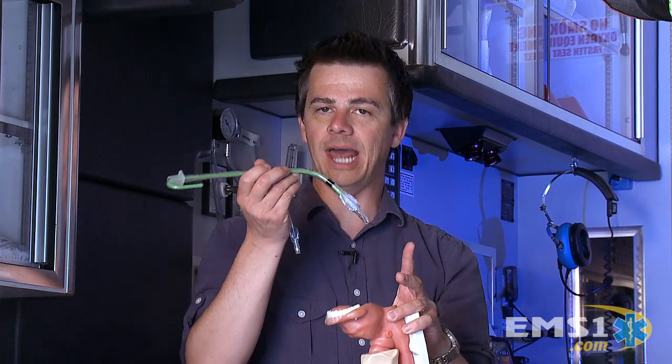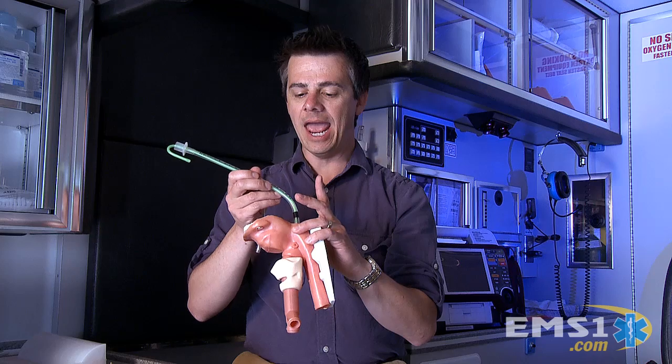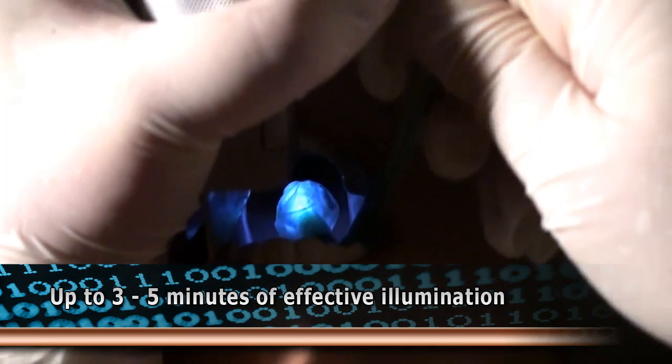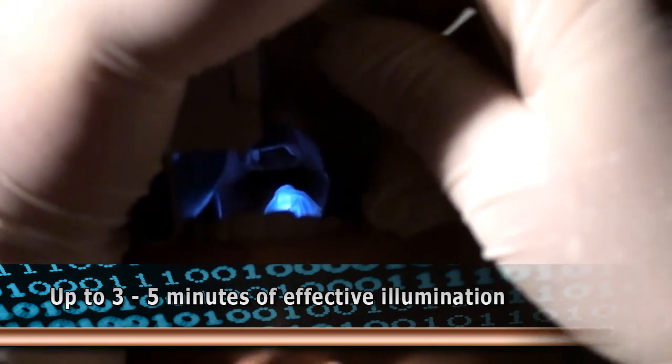You can make it just like a hockey stick and utilize it the same way. The neat thing about this is you can actually slide it in and while you're looking down there, even though you have the laryngoscope in there and can still see some of the structures, this just lights them up even further. As it's lighting them up, it fluoresces the cords. So when you see the white pieces on the cords fluoresce, you know you're in the right spot. If you're not, you're probably in the esophagus and you should back up and find them again.